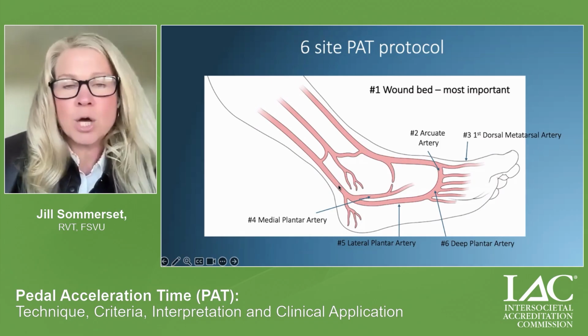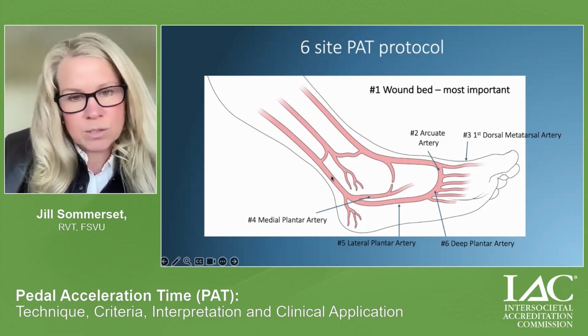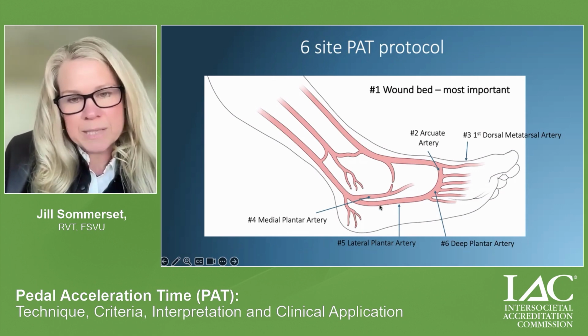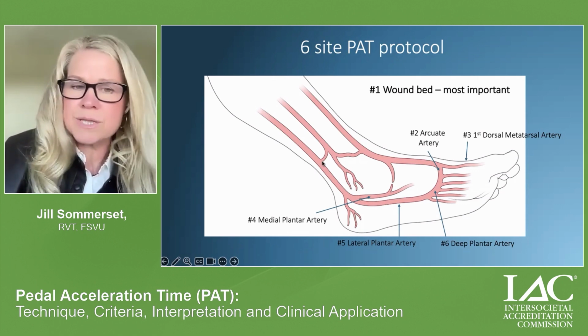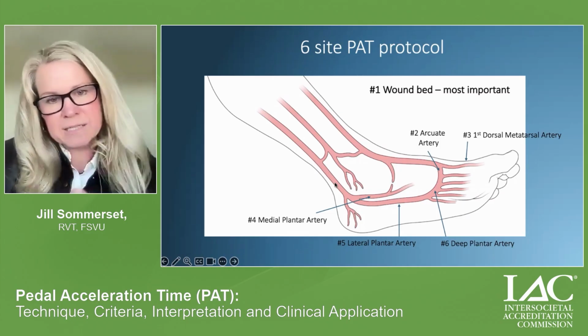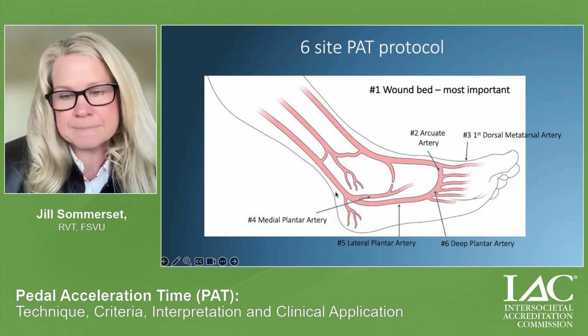Now, we all probably evaluate the posterior tibial artery to about the ankle, but it's really important that we keep scanning below the malleolar bone. Technically, this is called the common plantar artery, and then it's going to bifurcate into that medial and lateral plantar artery. A lot of disease sits here, so it's really important to scan a little distally, not to miss any disease in that common plantar artery.